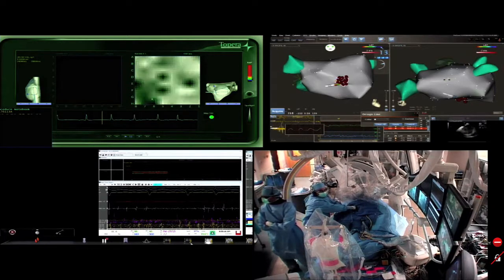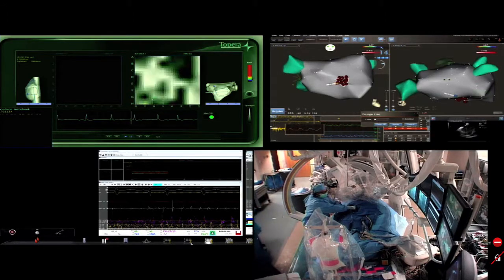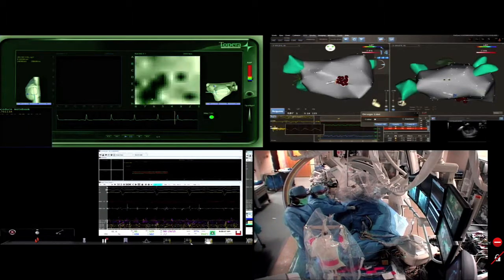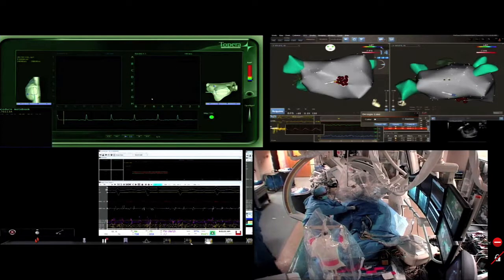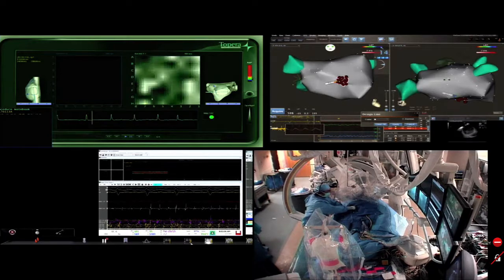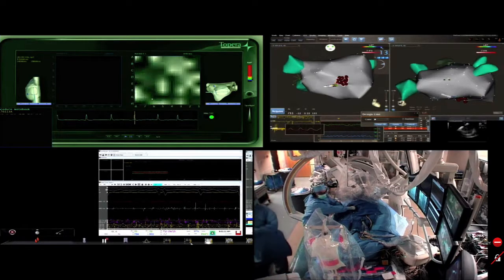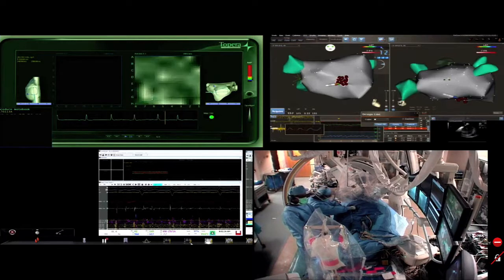So one additional question there, just to interrupt for a minute. You said you went up with big lesions, but how much of a trajectory do you have with these that you have to deal with? There may be a core, but then it moves, and are we talking about 4 centimeters? Oh, no, usually not as big. I would say that it's rather like 2-3 centimeters in most cases. It's probably not that big. David, how many rotors did you see in this case?